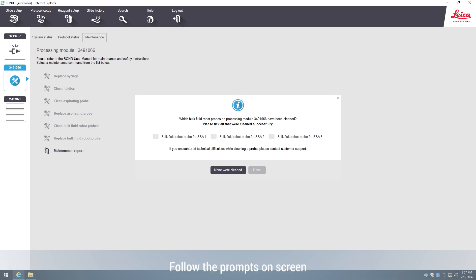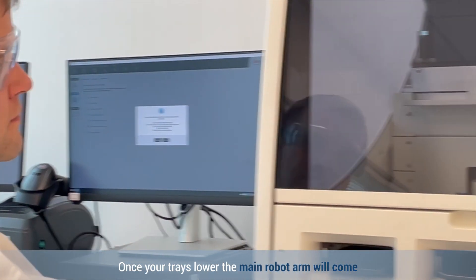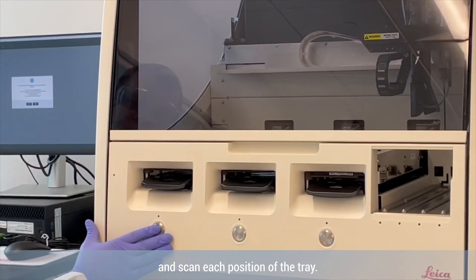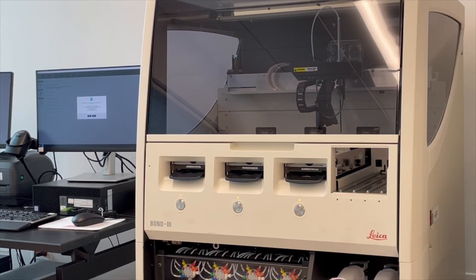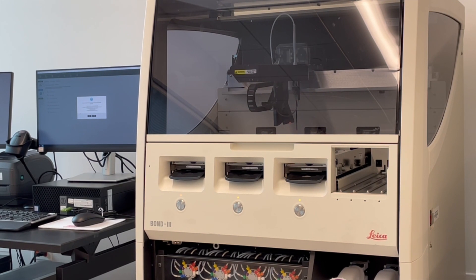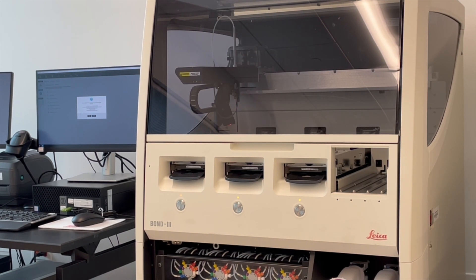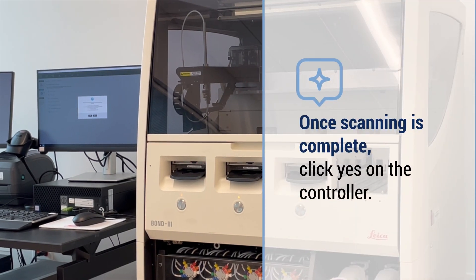Follow the prompts on the screen. First, load and lock staining trays. Once your trays lower, the main robot arm will come and scan each position of the tray. Once scanning is complete, click yes on the controller.